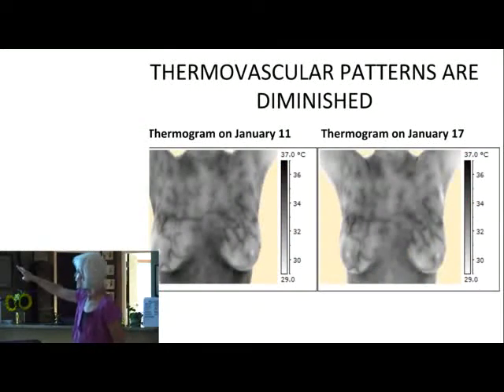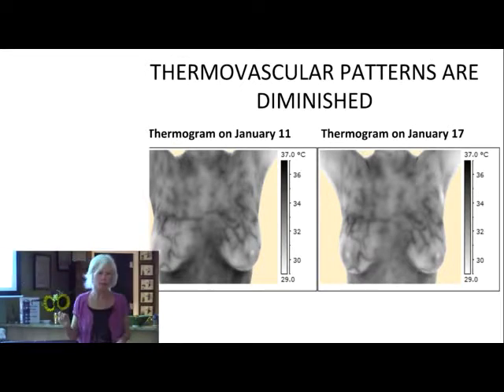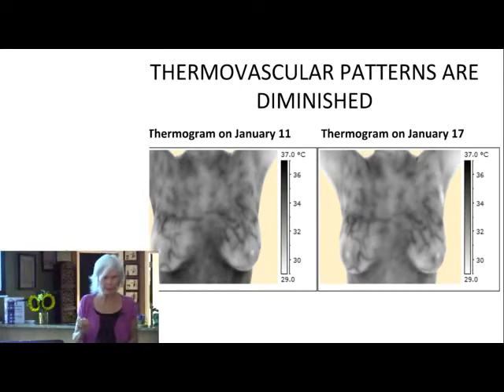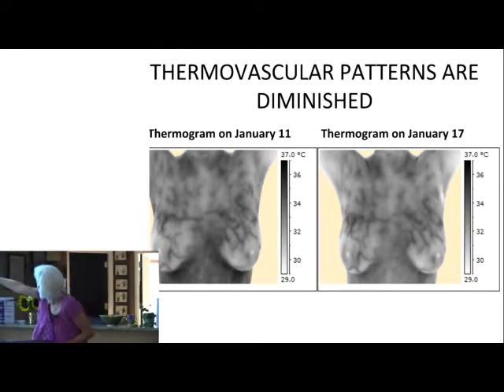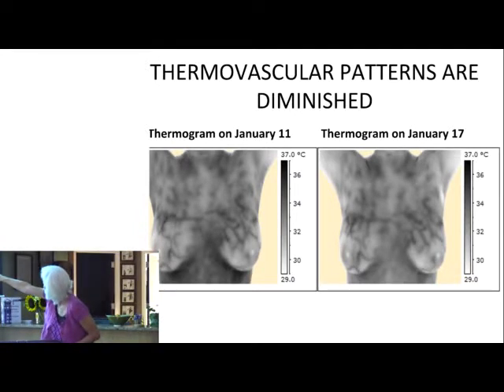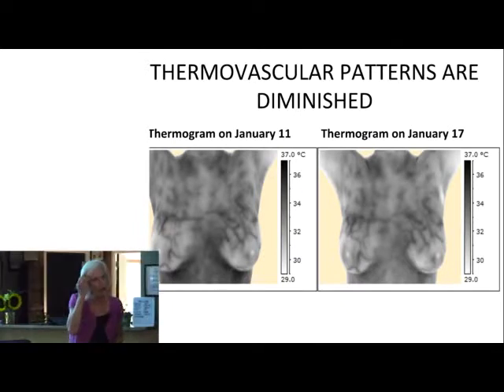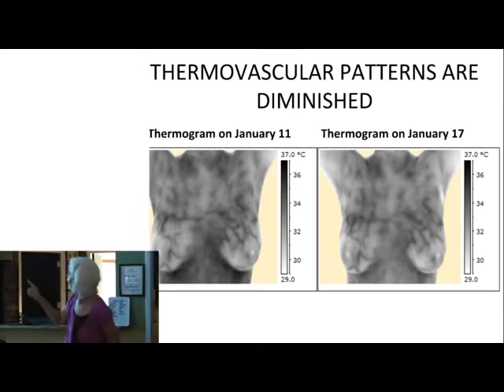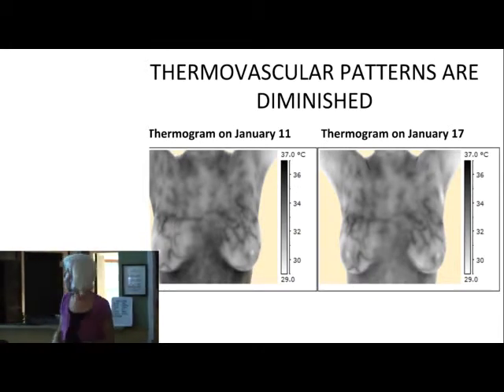And here, the same images of this airline pilot in the black and white. Now, this is subtle, but I wanted you to see this because everything about thermography is subtle. This was on January the 11th. Remember, she was high risk, 4+ in the left breast. And this is her thermogram on January 17th. After, you see the very slight dimming of the vessels. And it's slight, but it's there. And that's a reflection of improvement when you see these.